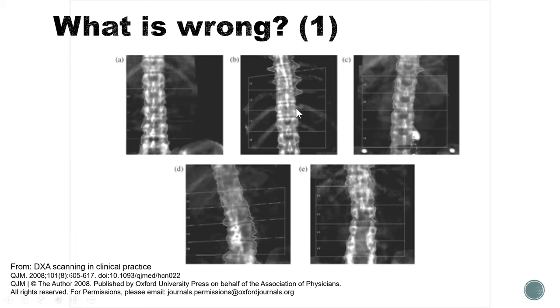Okay, this really looks wrong, right? Because basically you're trying to measure your lumbar spine. Your lumbar spine starts at L1 and your ribs end at T12. So this has been purposely put where it's just over the thoracic spine rather than the lumbar spine. C, there's obviously something there. This is actually a bit of metal, so obviously this would make the reading of this particular L4 a lot higher.